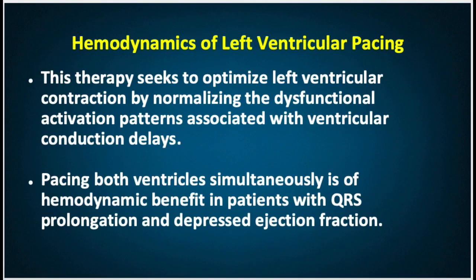Numerous acute studies have shown that pacing both ventricles simultaneously is of hemodynamic benefit in patients with QRS prolongation and depressed ejection fraction. Much uncertainty remains about the mechanism by which hemodynamic improvement occurs, but several factors are likely.